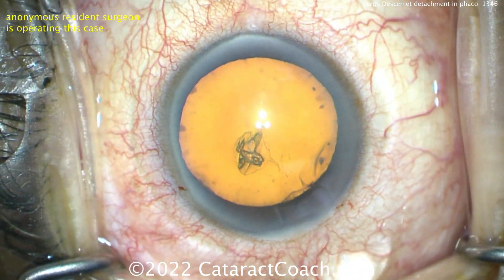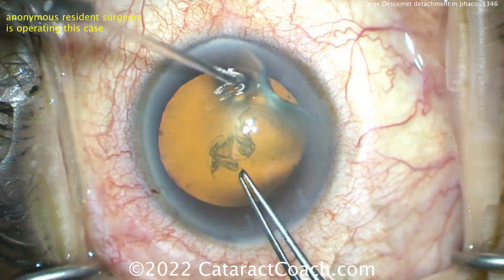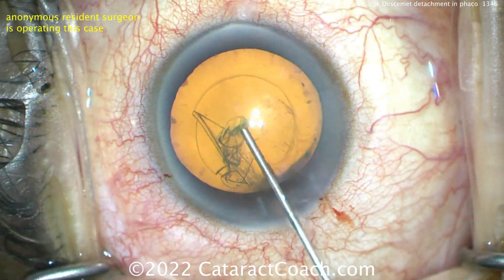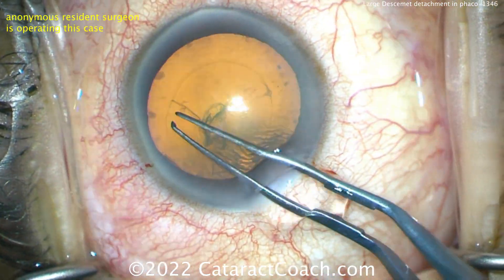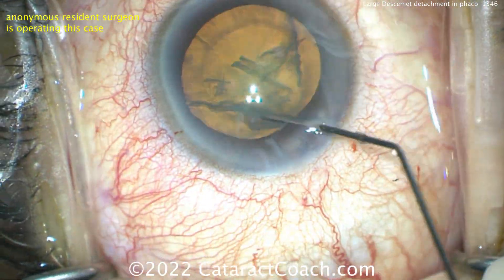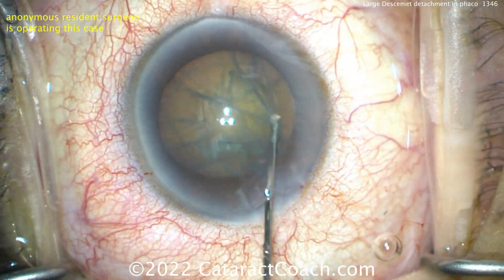I'm going to get through the cataract case pretty quickly, because that really wasn't the issue here. This resident has done about 50 or 60 cataracts so far and is doing a good job. More viscoelastic. The rhexis looks pretty good — very good for a resident case. Good hydrodissection being done. Does the nucleus spin a little bit? There it is.